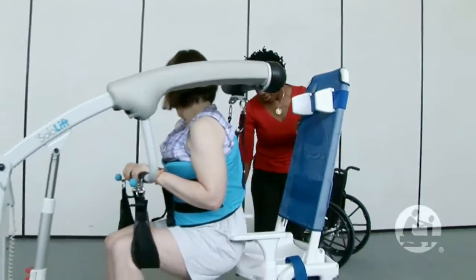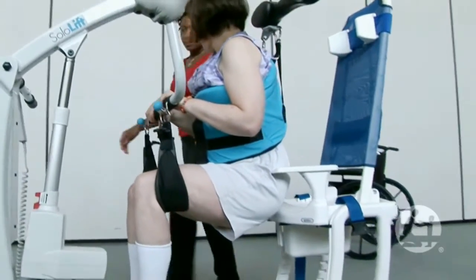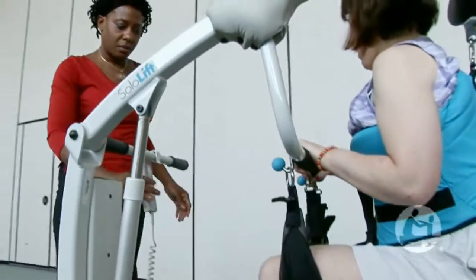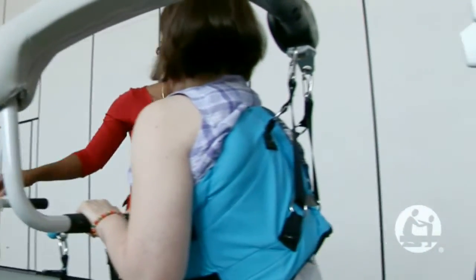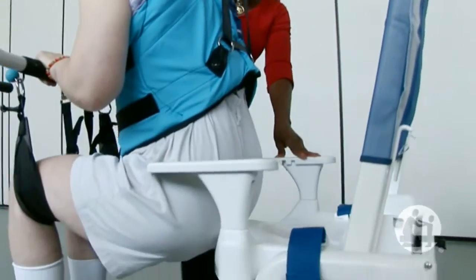When the vest is applied, it's a very simple procedure to transfer someone onto the toilet. You don't have a lot of work to do to lower the clothing. I think it helps preserve their dignity a little bit too, because you don't have to struggle with any clothing. I did find transferring from the solo lift back into the wheelchair easier to do.